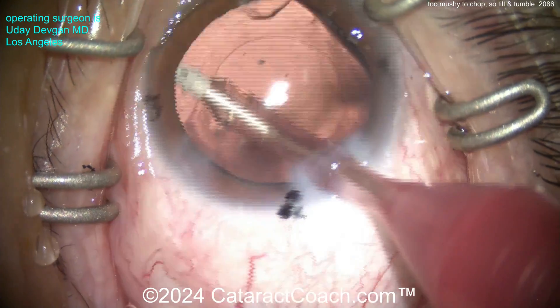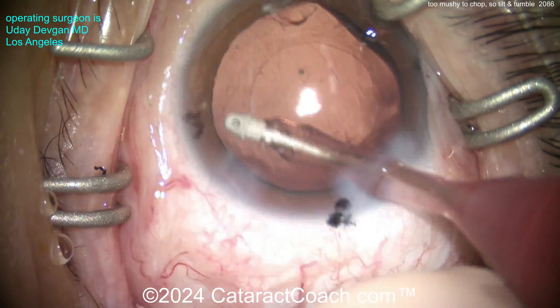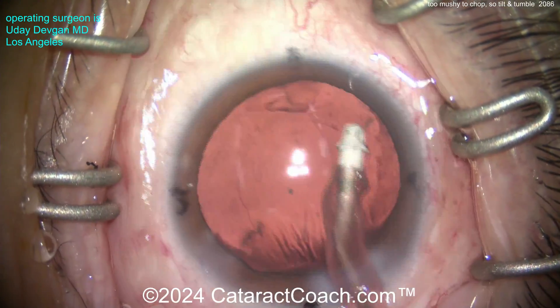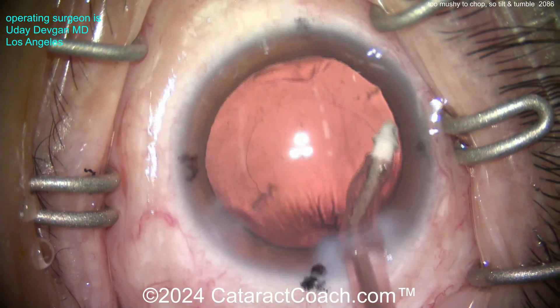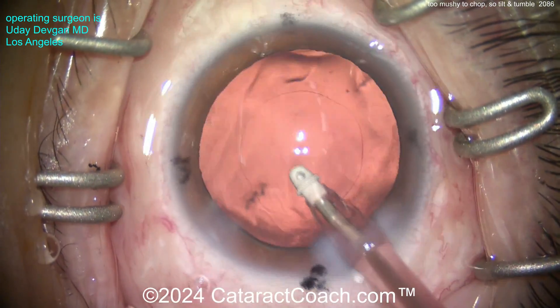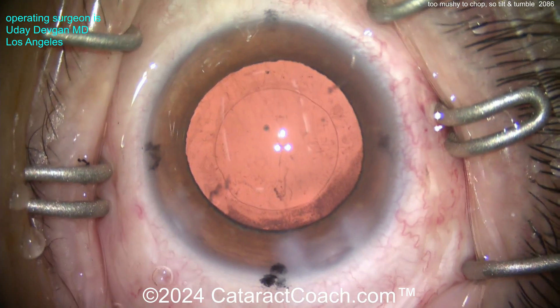Cortex is out. Using the IA probe to clean up some of that undersurface of the anterior capsular rim - doing a little capsule polishing with a low vacuum setting. I don't use an additional vacuum setting; I just use the same vacuum setting and titrate to a low degree of vacuum using my foot on the foot pedal. You can clean it up pretty well. With a bimanual IA you may have easier access to the sub-incisional space, but I think we've got it nicely cleaned up.